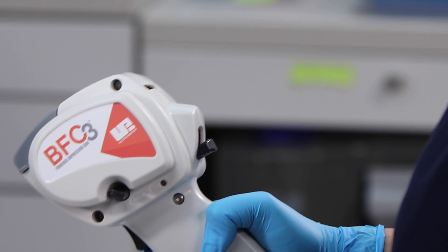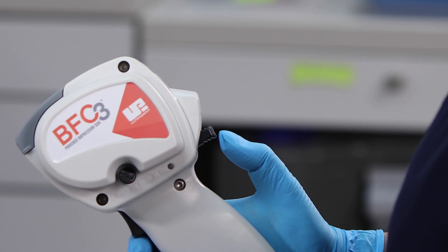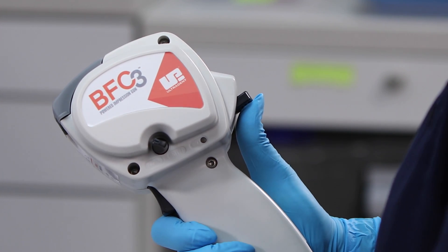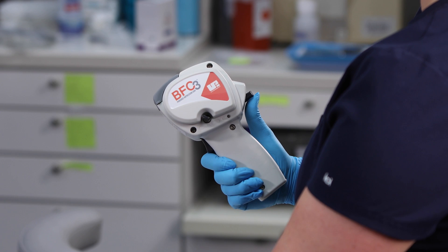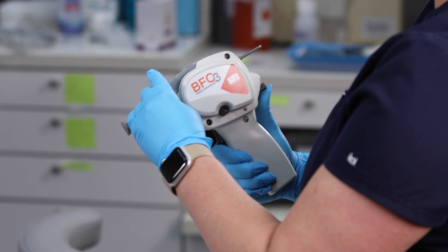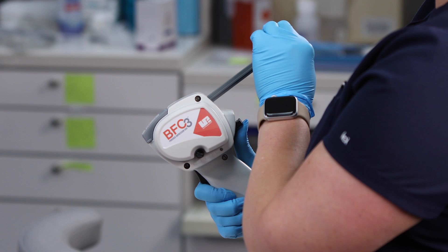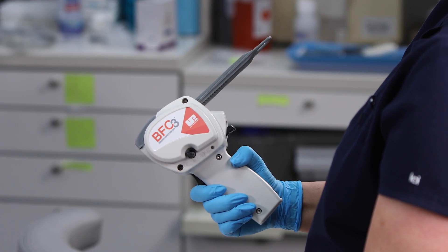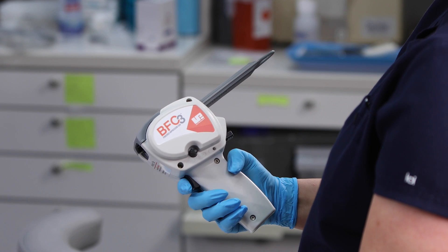Insert the plunger by holding the BFC3 Impression Gun in one hand and pressing upward on the plunger release lever with your thumb. With the other hand, insert the plunger teeth-side down into the plunger slot in the front of the unit and slide it back as far as it will go. Release the plunger release lever. The BFC3 Impression Gun is now ready to load.